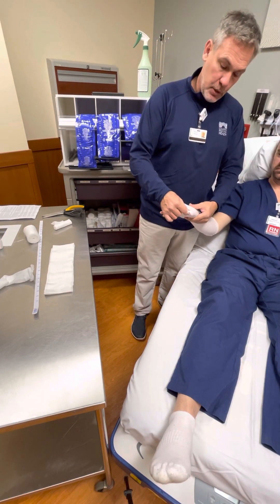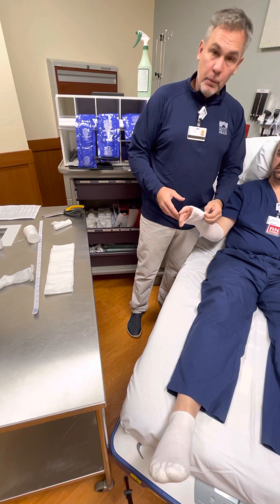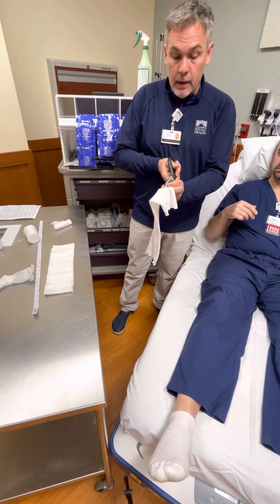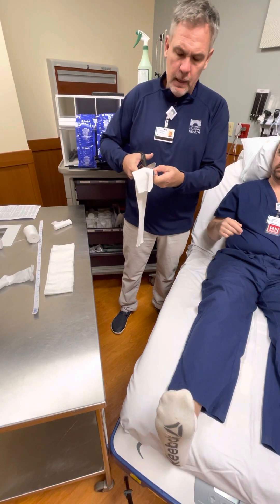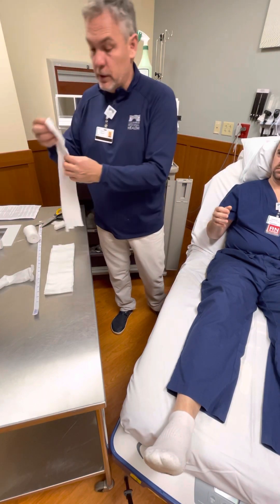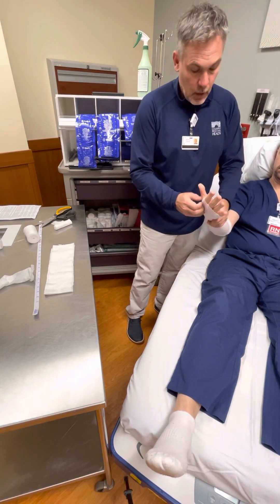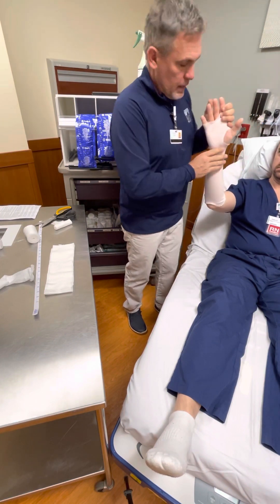We don't want the thumb restricted, so what I do is mark it with my finger, then pull it back off. I don't cut it on the patient because these patients sometimes are moving around and sometimes have very friable skin. All you're trying to do is just open up here so their thumb can go through - you don't want to injure the patient. Thumb goes through, and you make sure it's not causing any big wrinkles. Check his thumb and his hand.